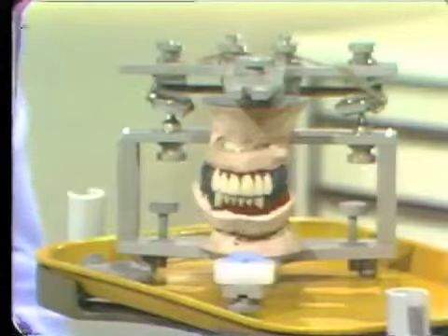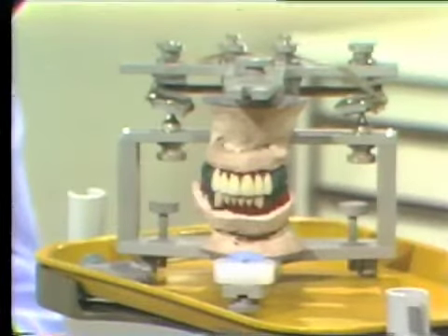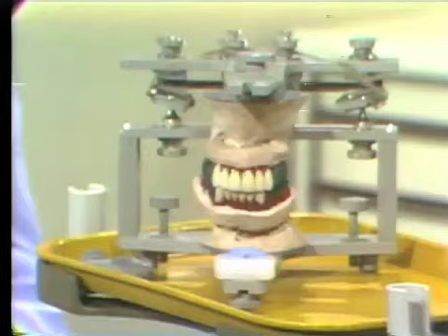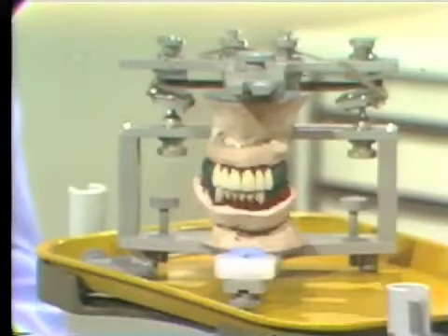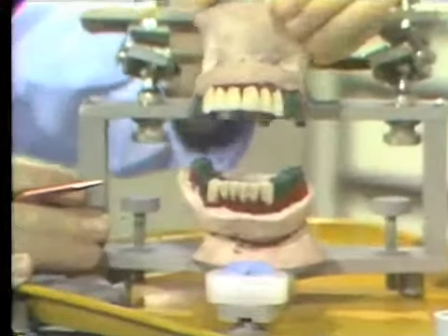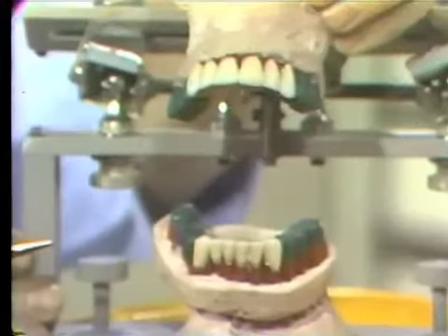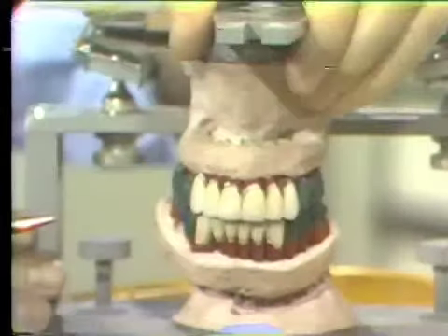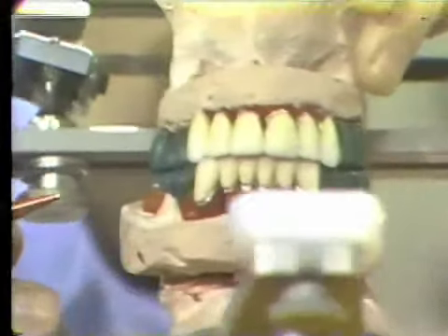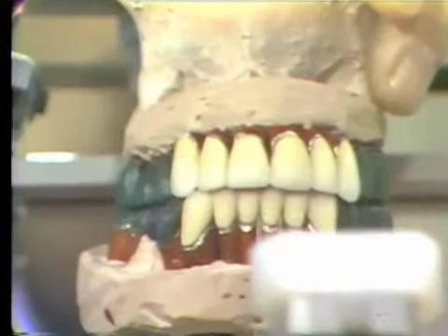We have the case back from the laboratory at this time. At this appointment, we want to establish our aesthetics on the restorations, verify the margins, and also establish our anterior guidance. At this point, we would like to be able to get rid of the incisal pin and adjust the incisal guidance. As you can see here, the posterior teeth are still in wax because we want to now refine our anterior guidance, make sure it's the way we want it so that the teeth will ride against each other and provide the guidance before we refine the posterior wax-up.